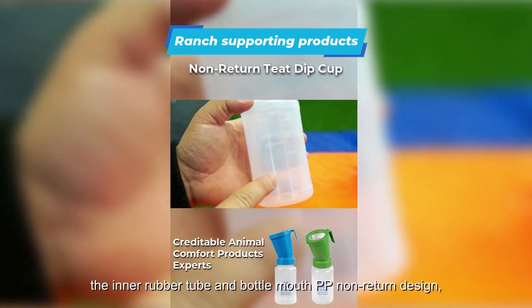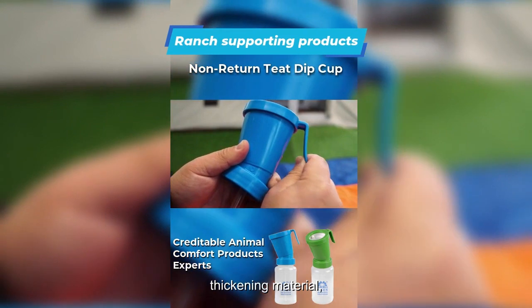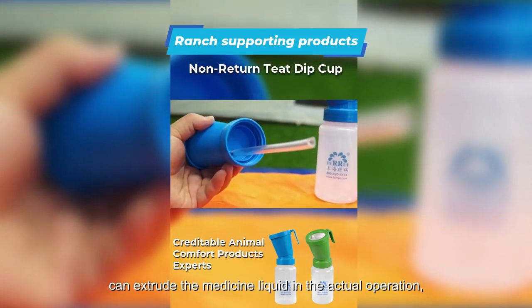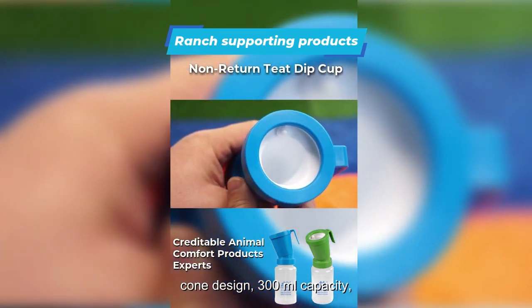The inner rubber tube and bottle mouth feature a PP non-return design with thickening material, allowing extrusion of the medicine liquid during actual operation. The cone design offers a 300ml capacity.